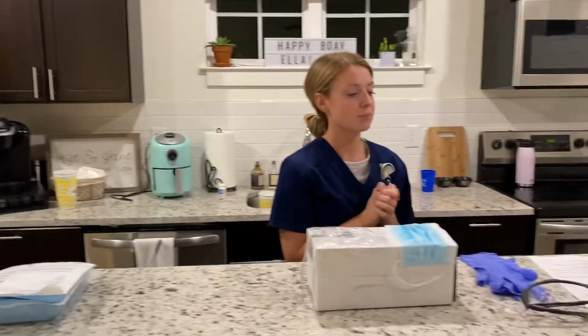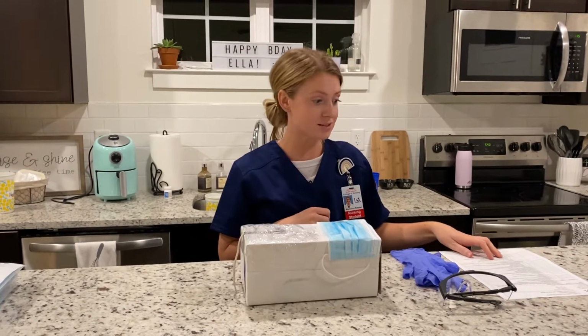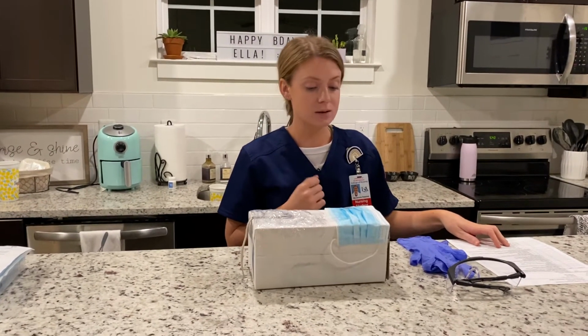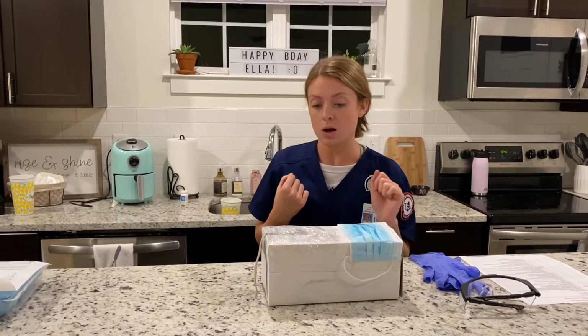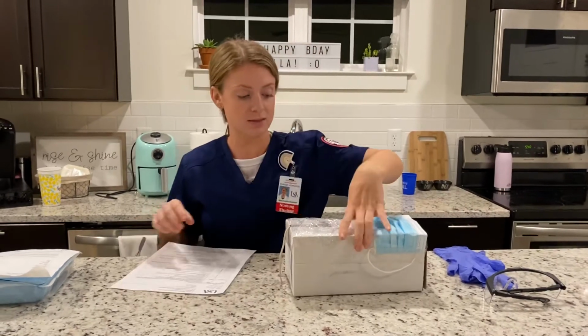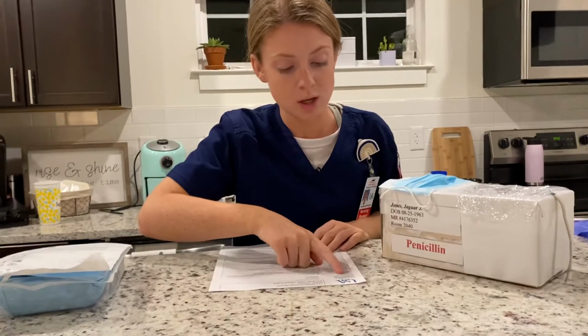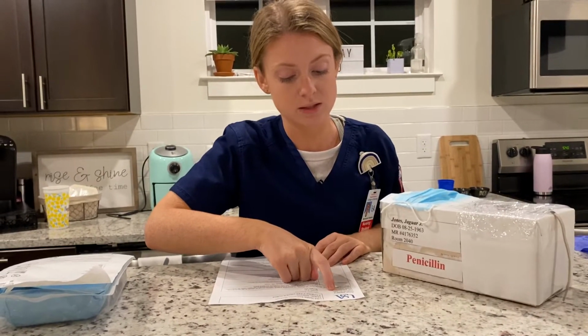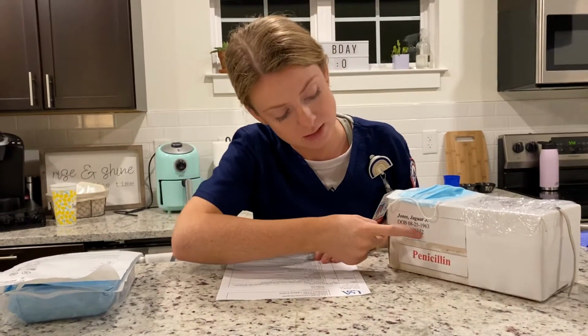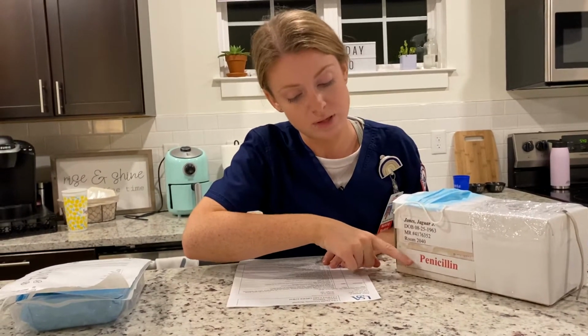So upon entering the room, I'll perform hand hygiene. I'm going to verify the patient's order and hospital policy. I am going to identify the patient using two identifiers. So I see that this is patient Jaguar Jones, born on 8/25/1963, and I see he has an allergy band to penicillin, and that is also on the order form.